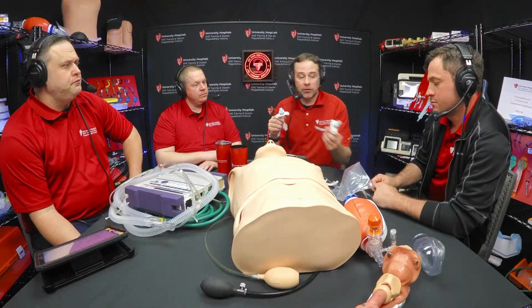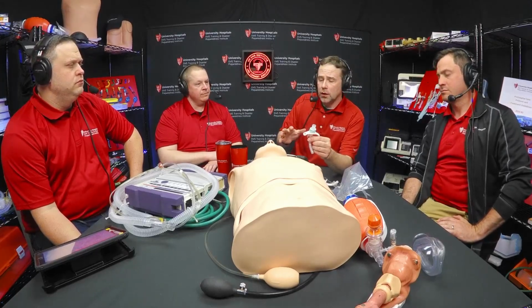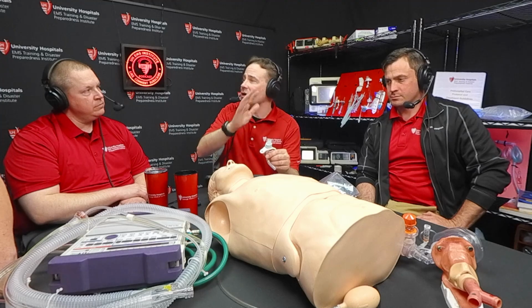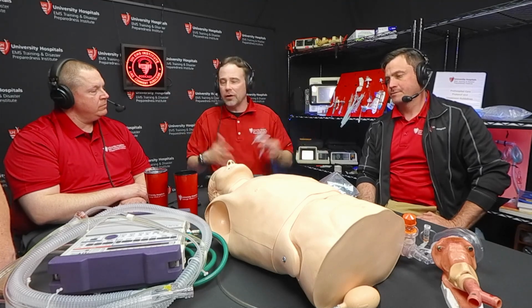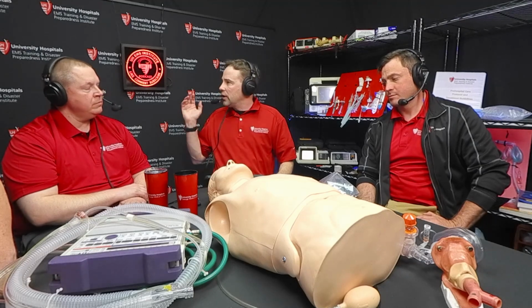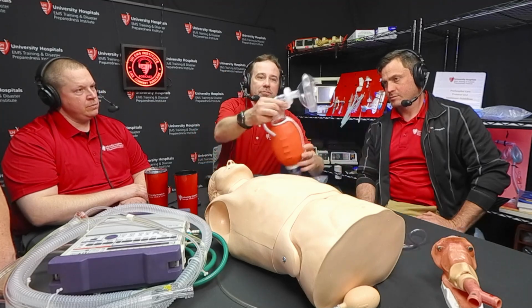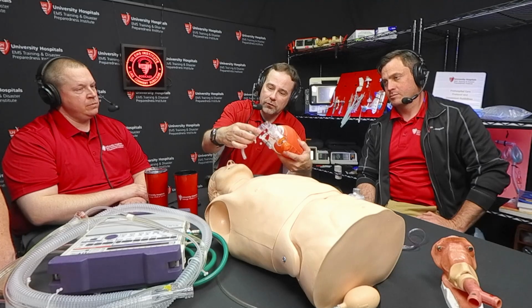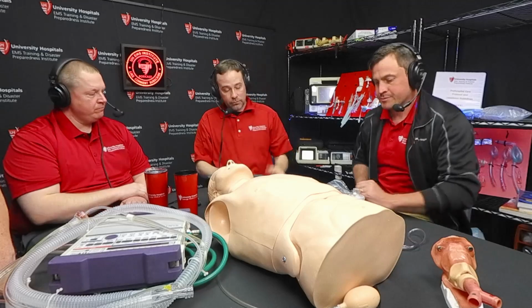Yep. Then conversely, let's say that you had a patient who's normally walkie-talkie AO4, right? They're generally in good shape. They're breathing on their own. But today, or let's say over the last couple of days, they're in route to respiratory failure because of ongoing pneumonia, and you're like, oh, I got to bag this patient. They're barely moving any air. Their end tidal's crap. They're hypoxic. Well, although a BVM absolutely fits on this uncuffed tracheostomy, when I squeeze this, we're going to get all kinds of leak out from the tracheostoma, right? So you got to do one of two things.